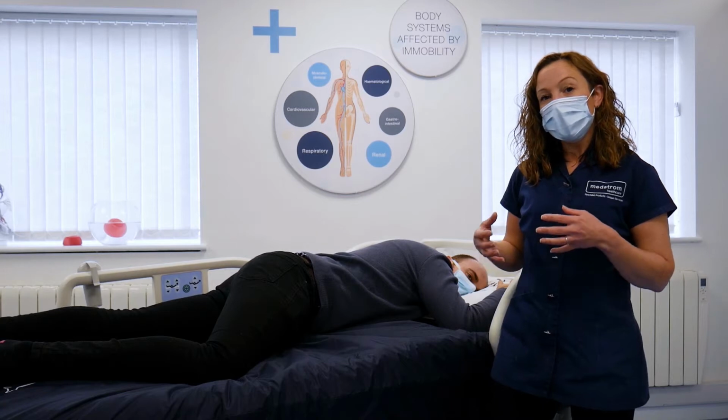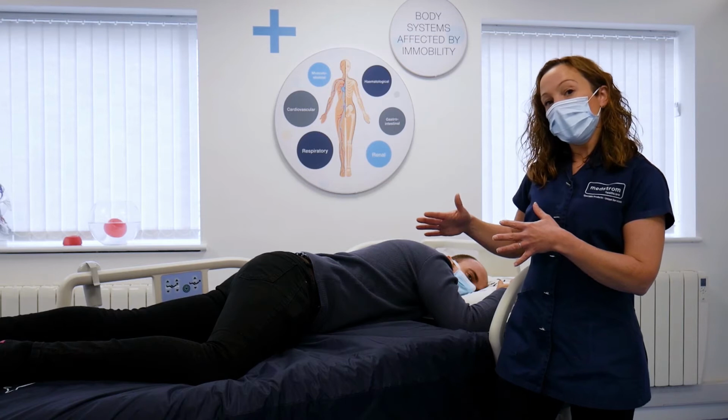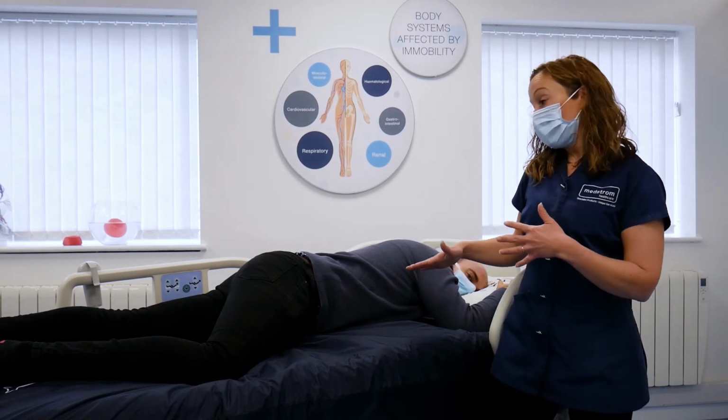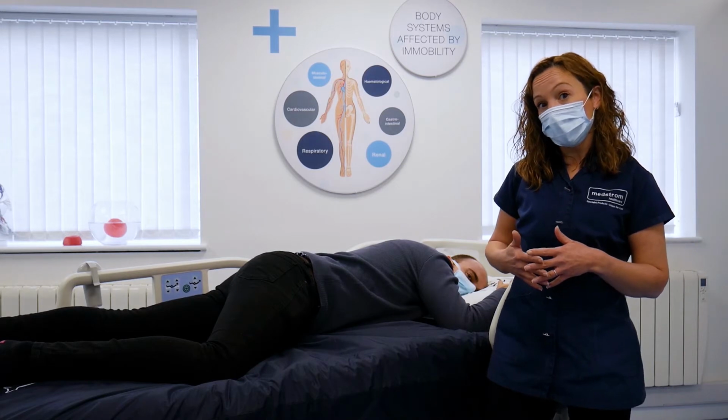The decision whether or not to put a patient in the prone position, what degree of reverse Trendelenburg to put the bed in, and whether or not the patient may be able to be repositioned once they're in the prone position will always be a multidisciplinary team decision.